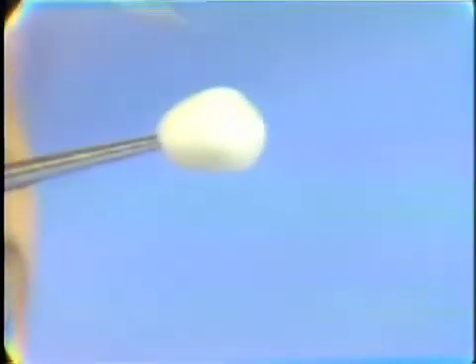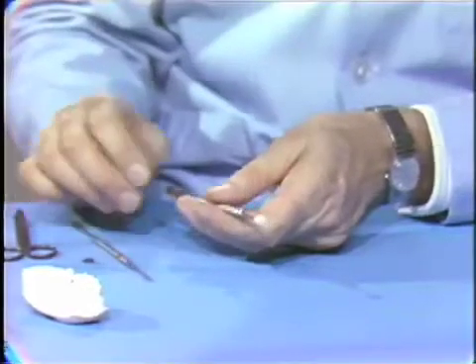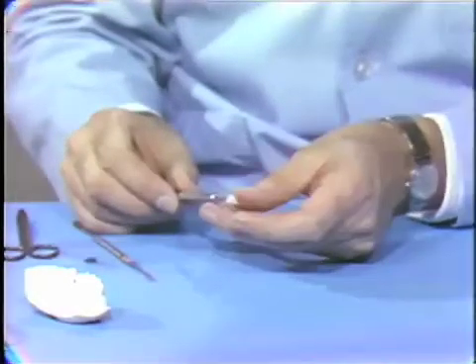The polished surface is never quite as glossy and shiny as the glazed surface of the normal Pontic facing, but should be quite smooth and free from any cut marks from the porcelain. So we're now ready to go ahead and adapt the metal backing to this.